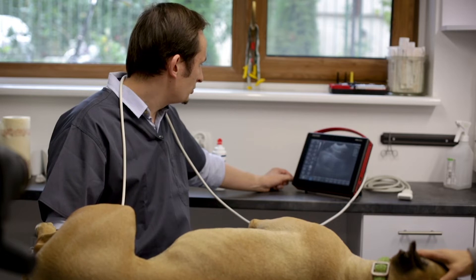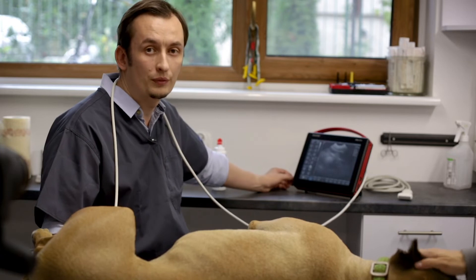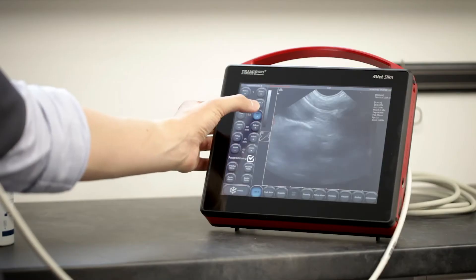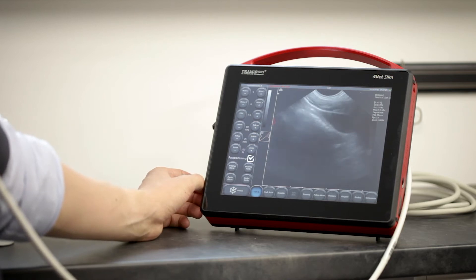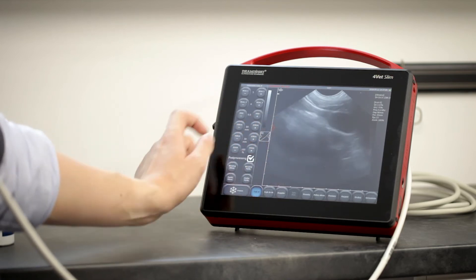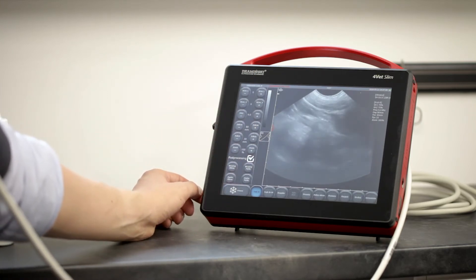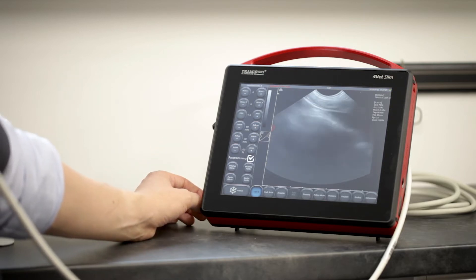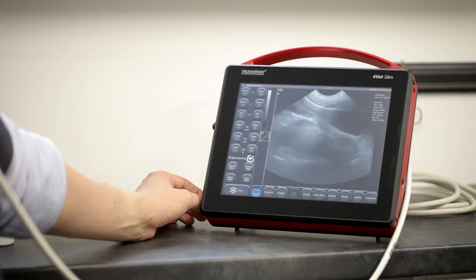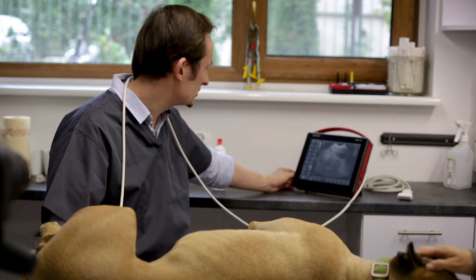If you would like to get the best image quality, we should remember to adjust the frequency. Remember the rule: the higher the frequency, the better the resolution, and the lower the frequency, the resolution decreases a little bit. So as long as we are able to reach the structure with a higher frequency, we should keep it as high as possible.